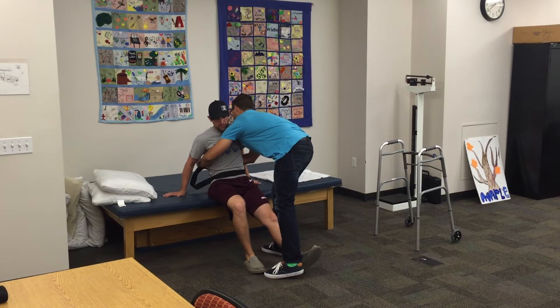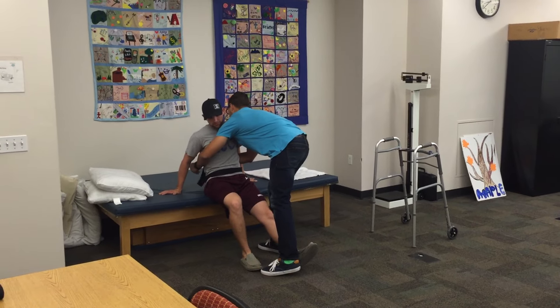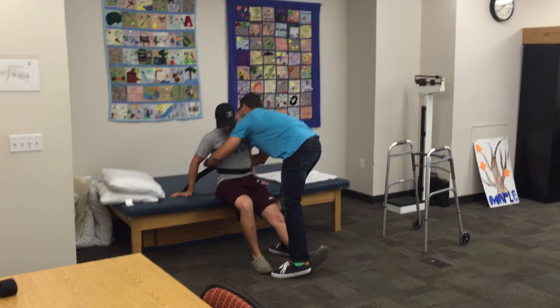How's that hip feeling so far? Not too bad — pretty good. No pain? No, not yet. All right. Use this as your baseline here. If it gets any worse or if you feel strange, just let me know.